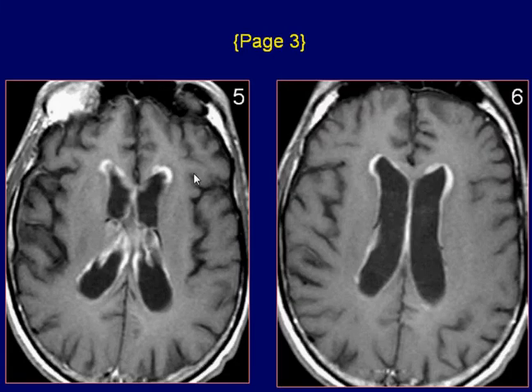Axial post-GAD T1-weighted images demonstrate multifocal ependymal enhancement in both right and left lateral ventricles.